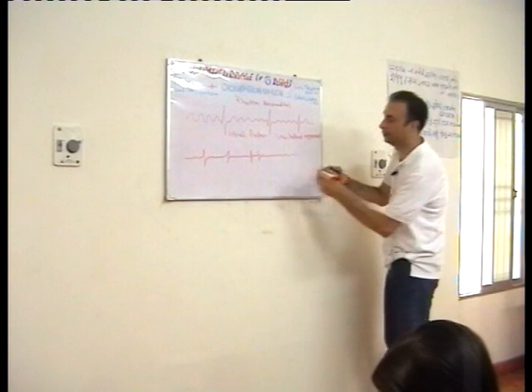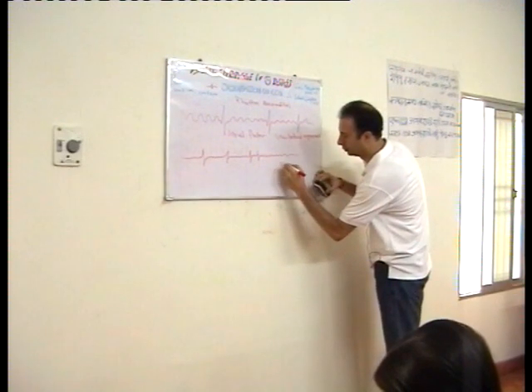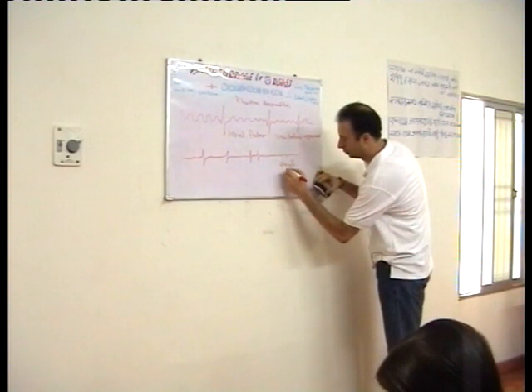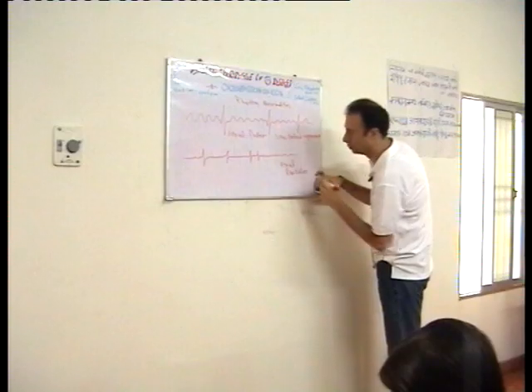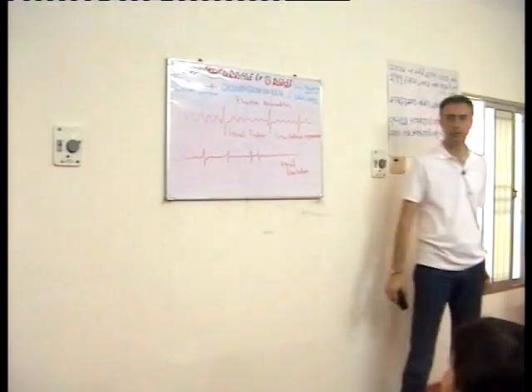Artifacts. Sir, you tell about artifacts also, sir. Our ECG machine produces fibrillation in every case.